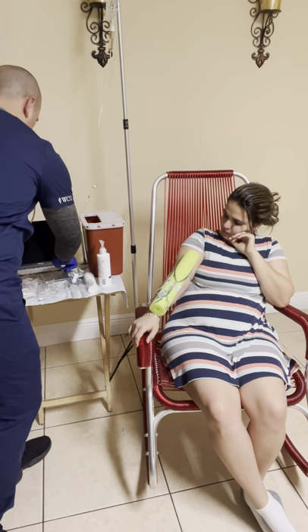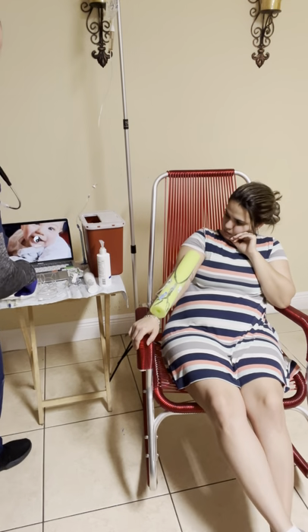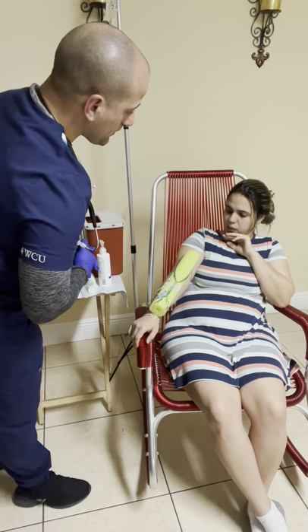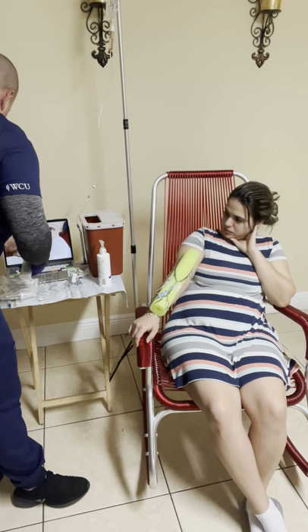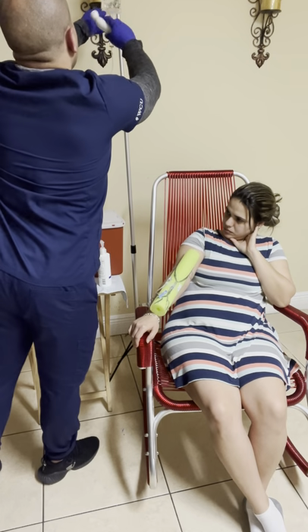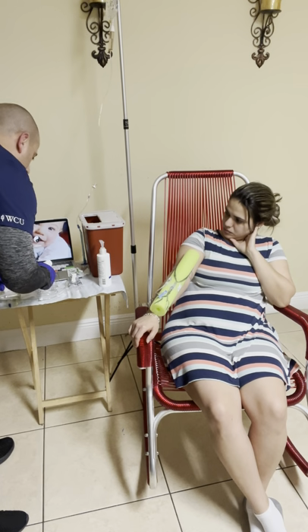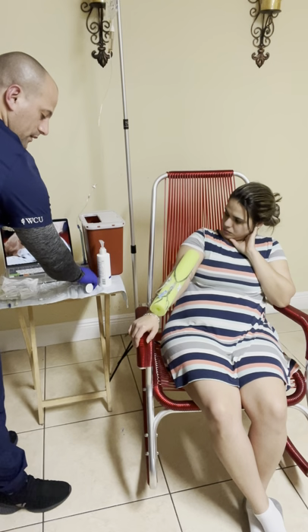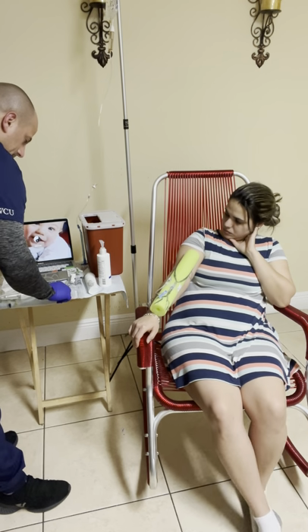I'm going to double check with the patient. May I have your name and date of birth? Rosalia Benedict. Okay. I'm going to check the IV bag with the patient's bracelet and the EMR. Okay.